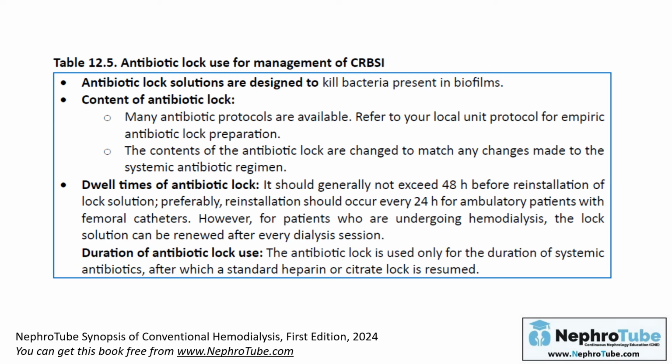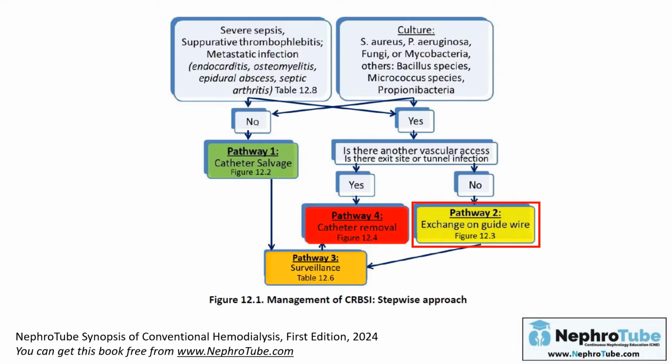Duration of antibiotic lock use, you have to use the antibiotic lock through the duration of the systemic antibiotics. For example, we mentioned in the previous slide that you will treat Staphylococcus aureus for 4 weeks. So we have to use antibiotic lock for 4 weeks and so on. Back to the main stepwise approach. We discussed now catheter salvage and its lines of management.